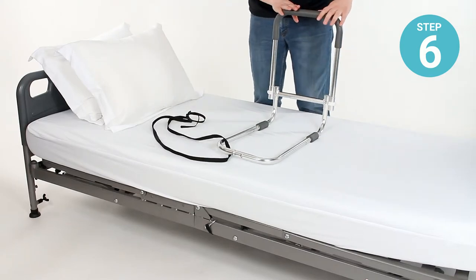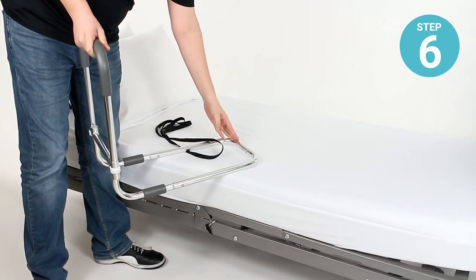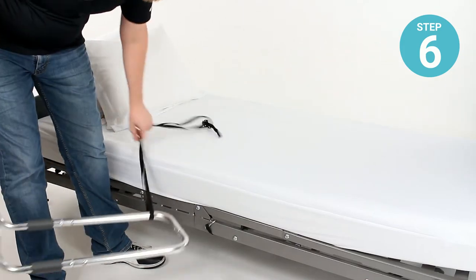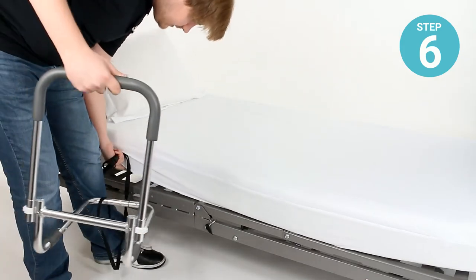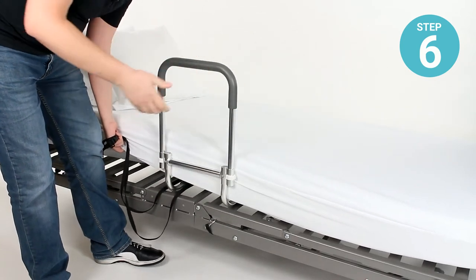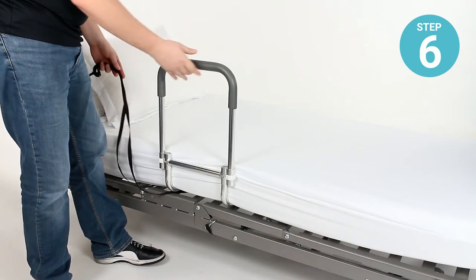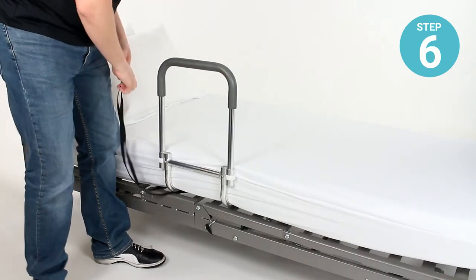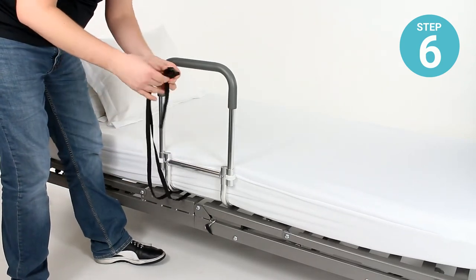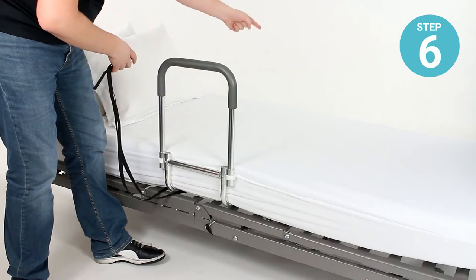Fit it underneath the mattress. The mattress can be lifted up and the rail can be positioned wherever you'd like. Depending on the needs and mobility of the patient, it could be moved up or moved down. For demonstration purposes I'll keep it centered here. Make sure, for simplicity's sake, that you leave the buckle connected while you're feeding it underneath the mattress.